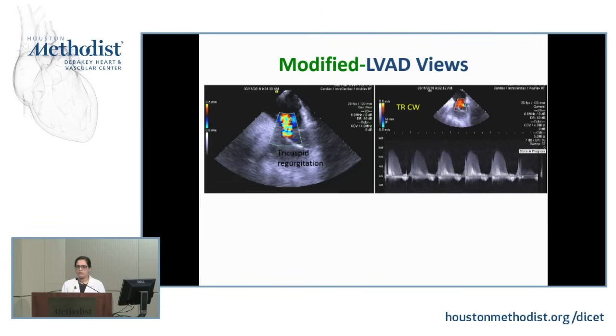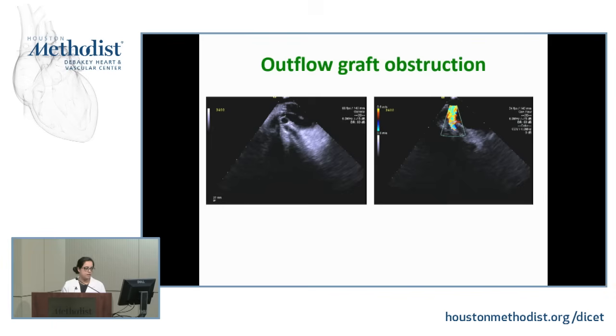TR is not so relevant because usually when you do ICE, you're concomitantly doing a right heart cath also, and with the same 8 French sheath that you put the Swan in through, you can put the ICE catheter in through. So you really don't need PA systolic pressures and those kinds of things, but it's a nice thing to see when you're looking at the TR jet and seeing how dilated the annulus is.